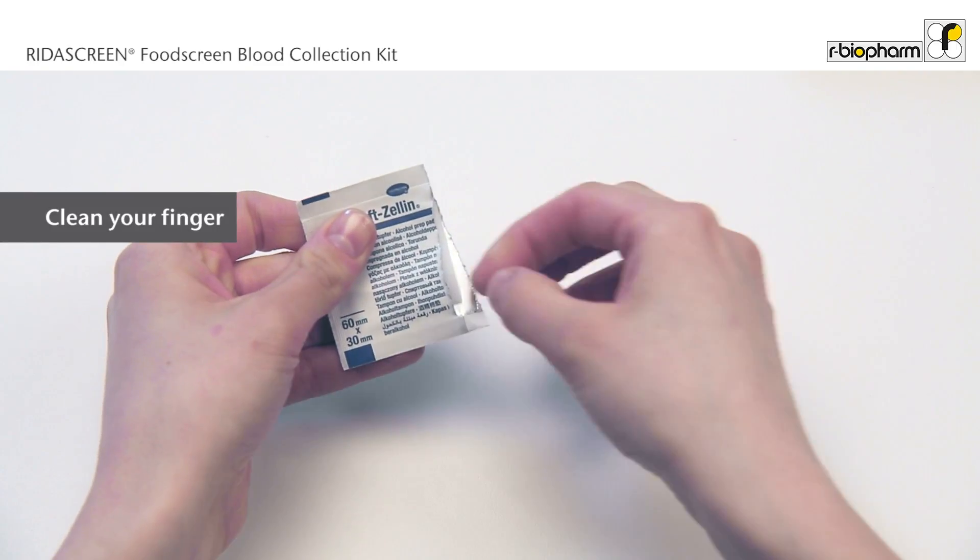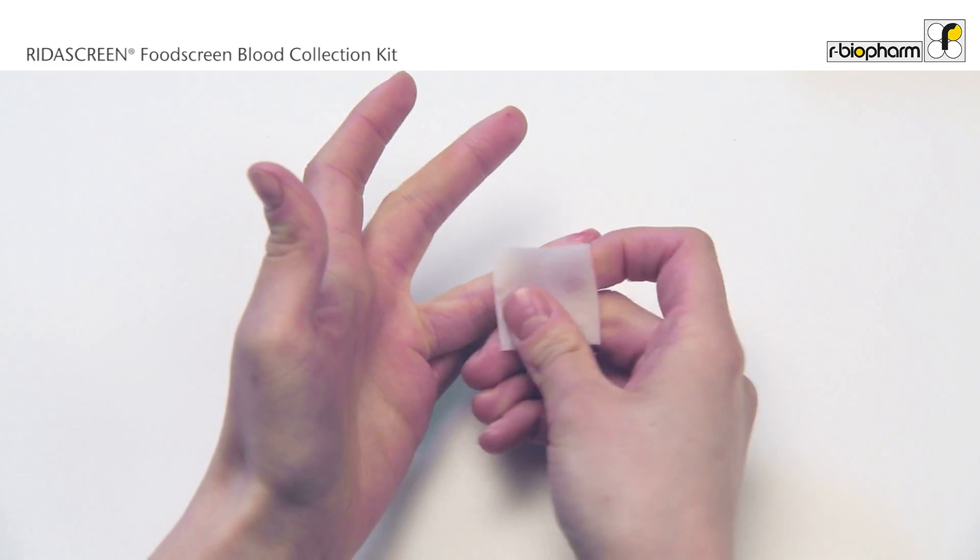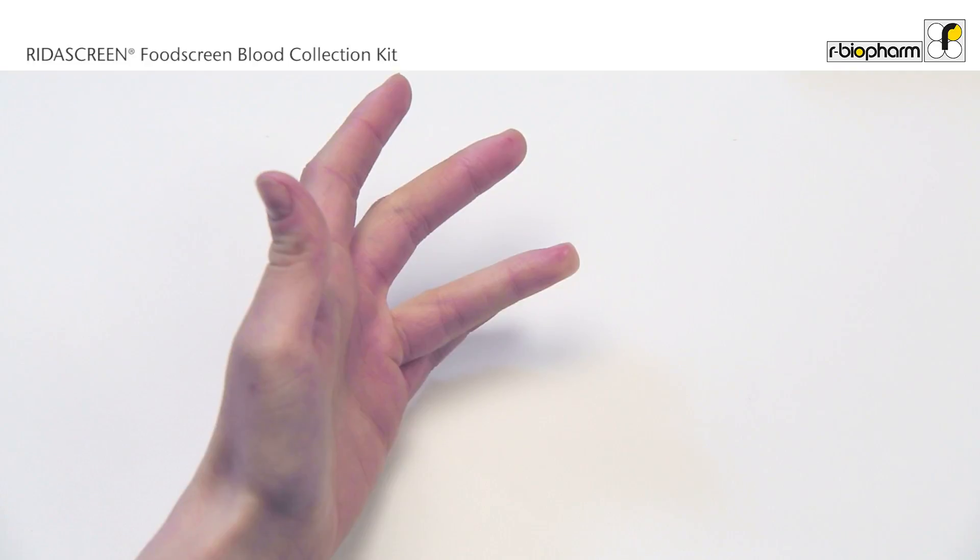Clean the finger with the provided alcohol swab and let your finger dry. Use this time to relax your arms.